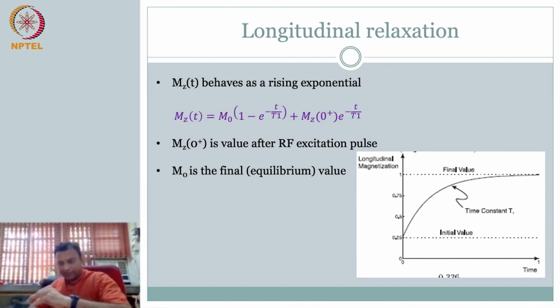Remember, my signal is only the transverse component. So the moment it's dephased, the signal goes down. So there is no fun for me to wait all the time. That means the signal is going down and down and down, right? You're going to hit the noise floor. So I don't want to really wait till it goes and then comes back and then measure within T2 time, right?